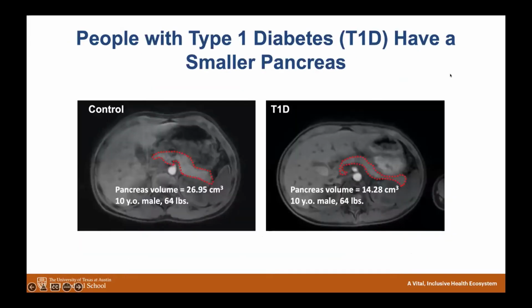So after these forays into optical imaging and then nuclear imaging, I moved into MRI. One of the nice things about MRI is it doesn't require any radiation. It's not like an X-ray, where we're shining X-rays that cause ionizing radiation and affect the DNA, causing mutations and possibly cancer. MRI doesn't do that. MRI is just a big magnet. As long as you don't have any metallic implants in your body, MRI is safe. We can do it in kids. We can do it repeatedly in kids, and we've done that now.